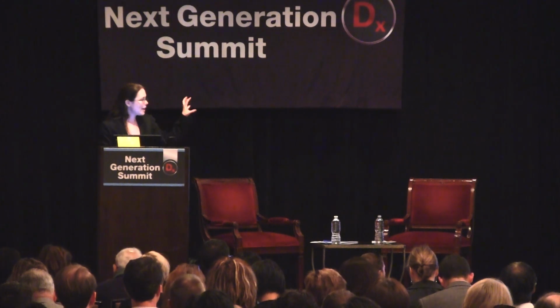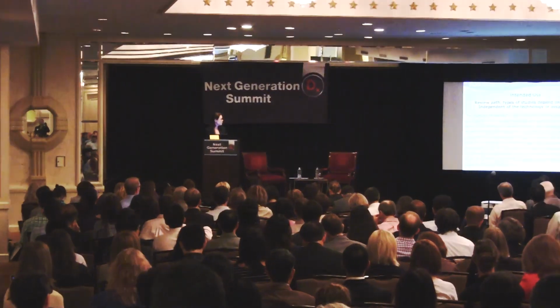So now bringing my focus back to the assays, they actually serve as a great case study for how we thought about and the kind of information we asked for in association with the clearances. In terms of the major elements of an IVD submission to the FDA, the intended use and the indications for use, if you don't know by now, is the key to how we review, the key to what we look at. The review path and the types of studies all depend on the intended use claims, independent of the technology or assay format. So absolutely give thought and consideration to the formation of your intended use statement.